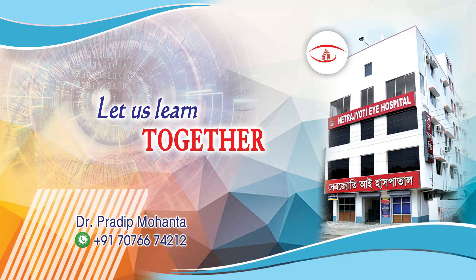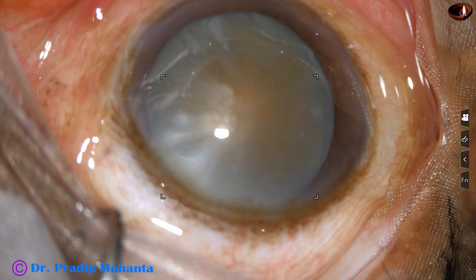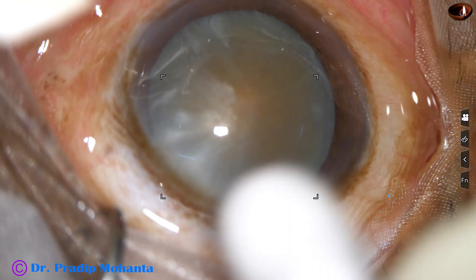Friends, welcome to my workplace at Ranagh Heart, West Bengal, India. This is a hard cataract. Let us observe this surgery.